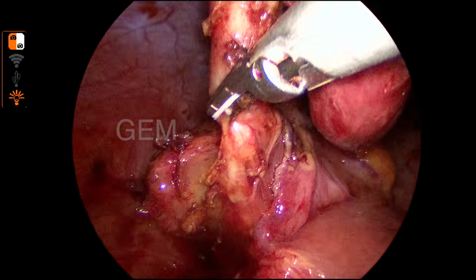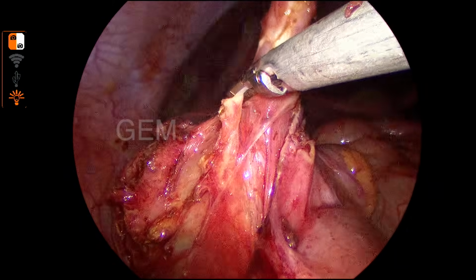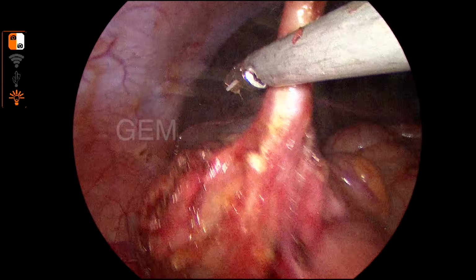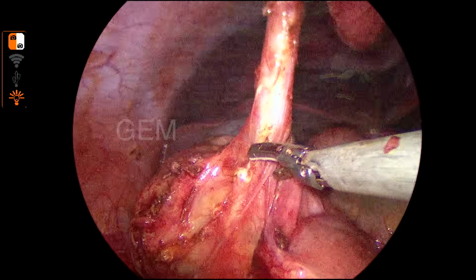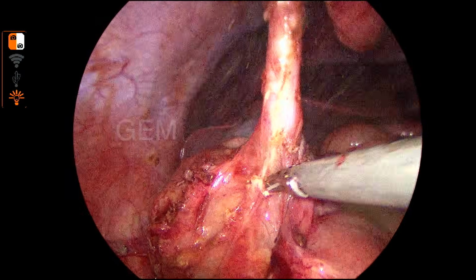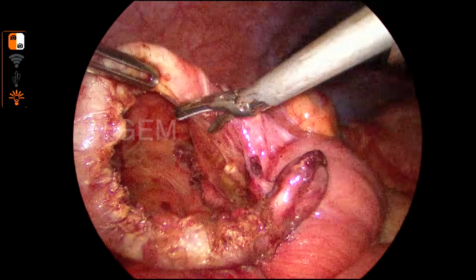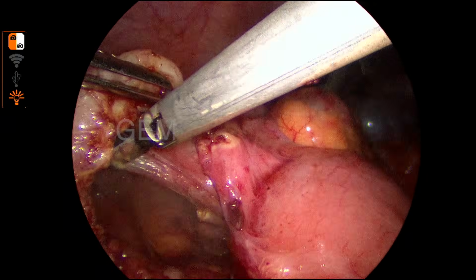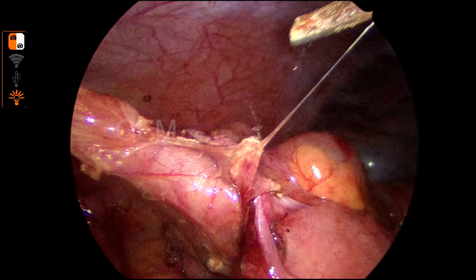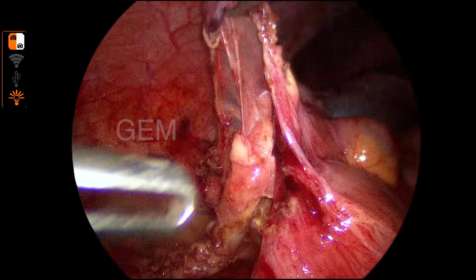So okay. So now I have started skeletonizing the base of the appendix. Hereafter it is like a normal appendectomy. So you can appreciate the thick walled appendix treated outside with antibiotic. And always try to go to the base. Don't leave some part of the appendix. Always take this kind of fascia first. So now you can see that is the base.